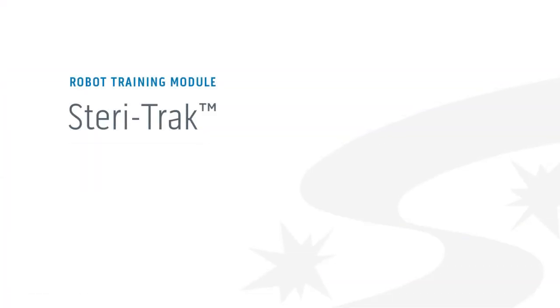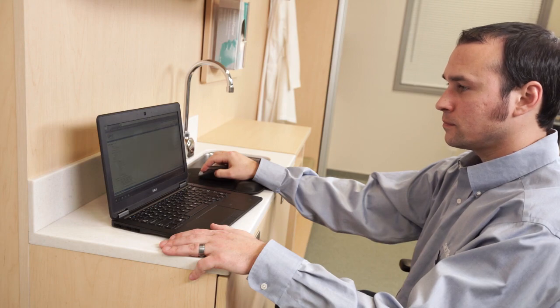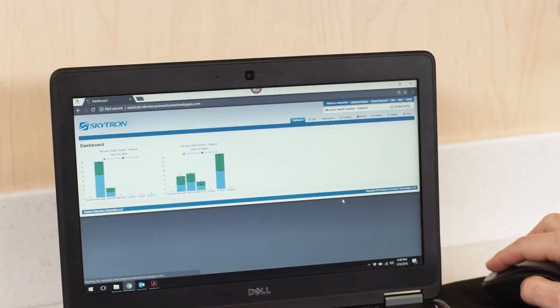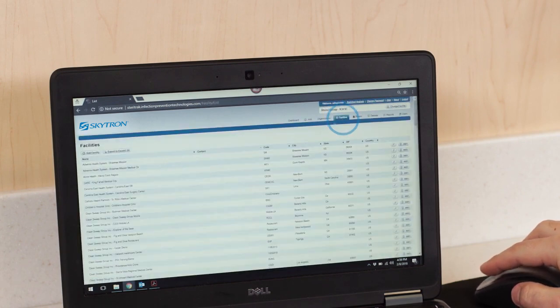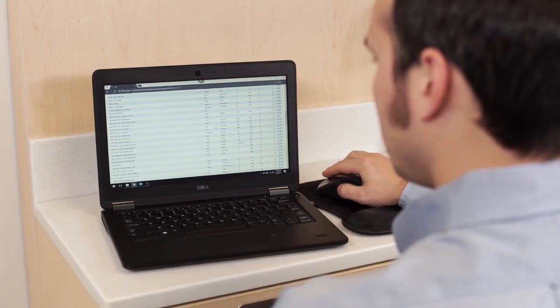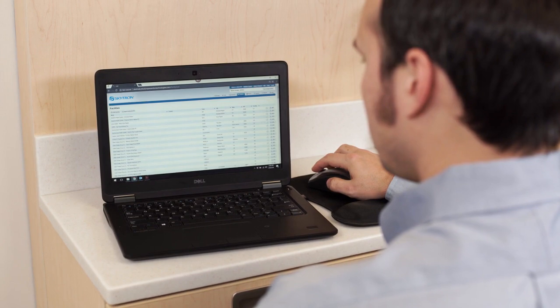The Steritrack web application tracks all configuration information and job data for the UVC units and remote handhelds, syncing data between Steritrack and the handhelds over the internet. Starting with the dashboard, you'll see charts showing the number of scheduled and completed jobs in the system, including jobs for the current facility from the current and previous week. On the Jobs tab, you'll see all jobs in the system and their last known status; sort by selecting any column header. The Facilities screen keeps track of all facilities configured in Steritrack, where each facility corresponds to a physical building for a particular hospital or hospital system.